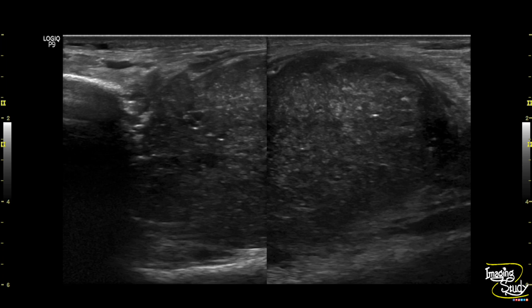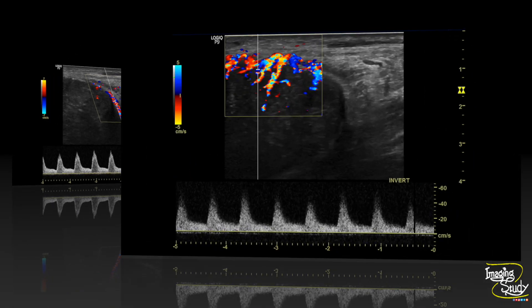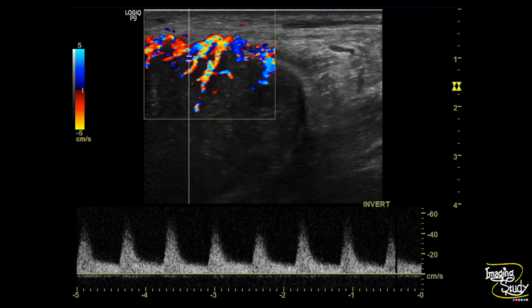We checked the spectral Doppler of the main feeding artery arising from the posterior tibial artery. It shows high peak systolic flow with a good amount of flow on diastole, which is a common vascular pattern of malignancy. The feeding branches show relatively less peak systolic velocity but still a good amount of flow on diastole.